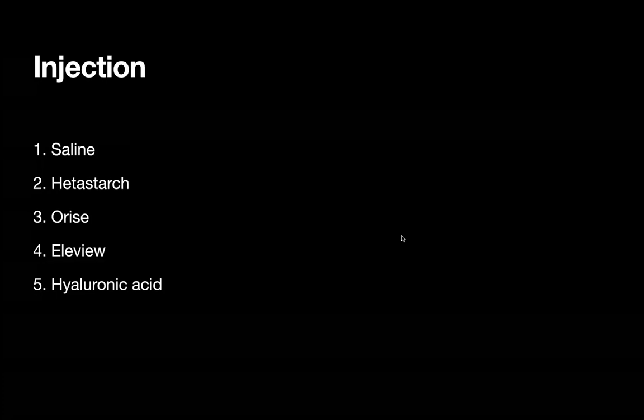All right. So it's interesting that half of the group prefer saline, and the next is Eleview, followed by Orise and Hetastarch, and a small proportion hyaluronic acid.